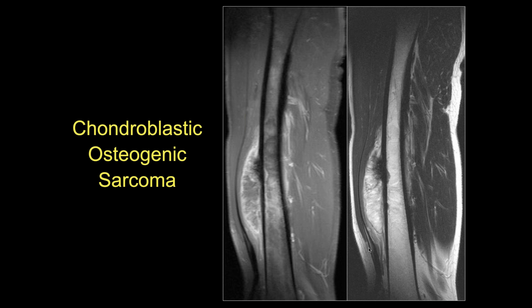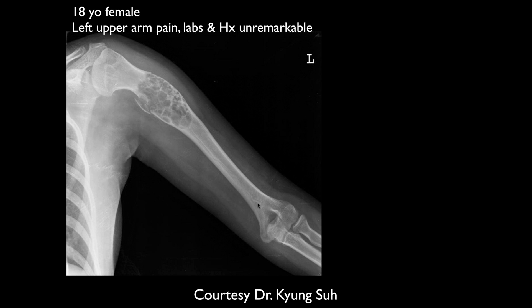A little bit unusual in that this is primarily involving the periosteum. This was a chondroblastic osteogenic sarcoma, and there is certainly some abnormality within the marrow space. But most bone tumors will primarily affect the medullary space and extend out and blow through the cortex. So this is a little bit unusual — a chondroblastic osteogenic sarcoma. But you described it really as a malignant lesion, and so it really has to be worked up as such.